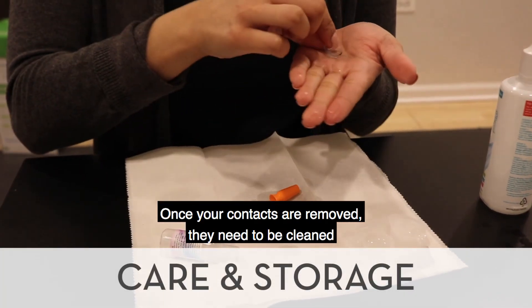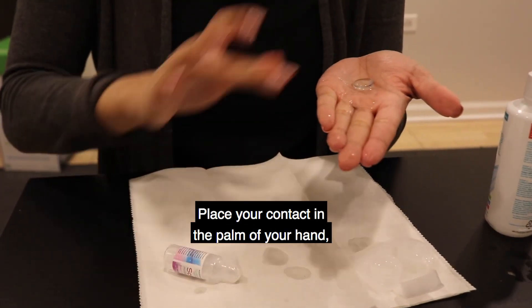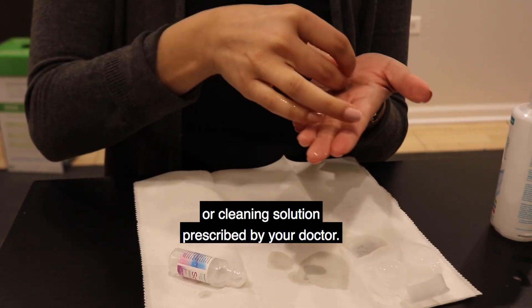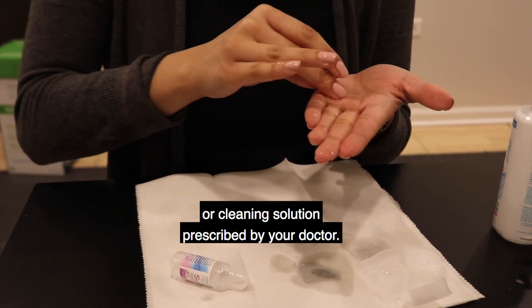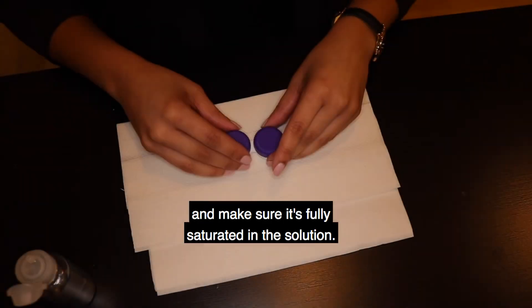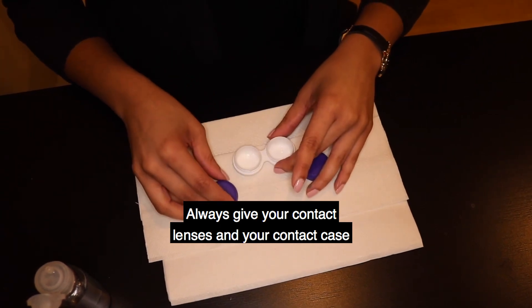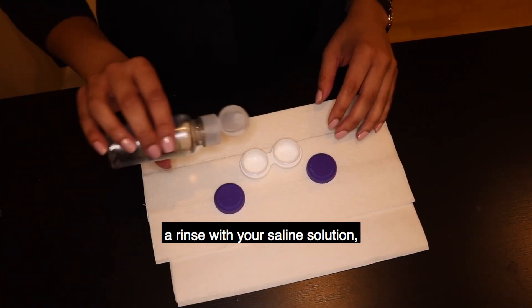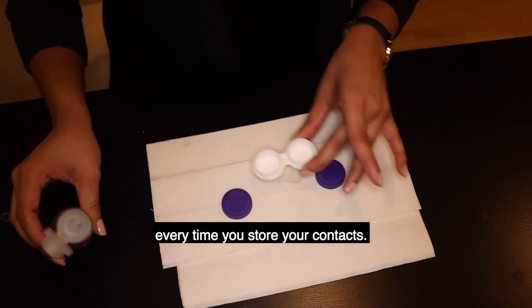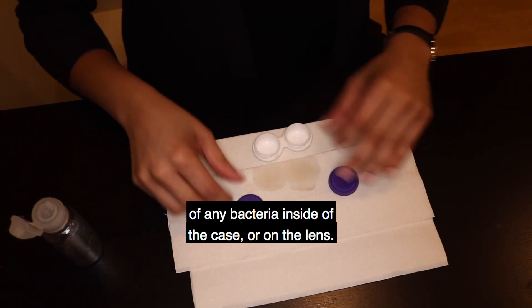Once your contacts are removed, they need to be cleaned to avoid any buildup of protein or debris. Place your contact in the palm of your hand and use three to four drops of the saline or cleaning solution prescribed by your doctor. Gently roll the contact in the palm of your hand and make sure it is fully saturated in the solution. Always give your contact lenses and your contact case a rinse with your saline solution and make sure that you are using fresh solution every time you store your contacts. This step is so important to stop the growth of any bacteria inside of the case or on the lens.